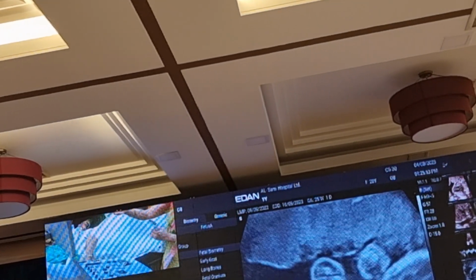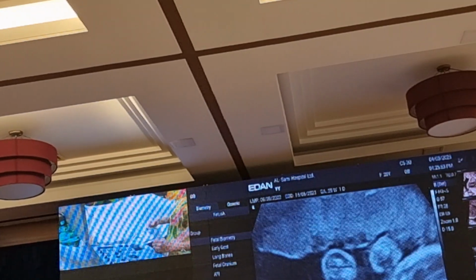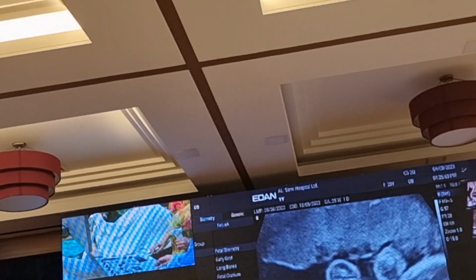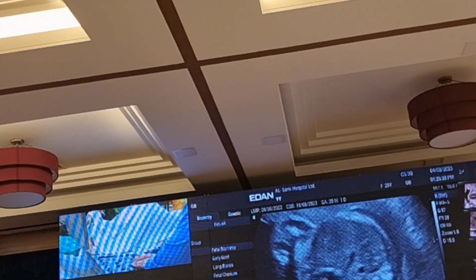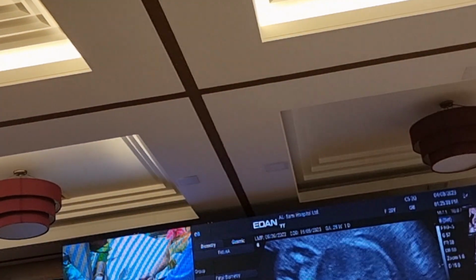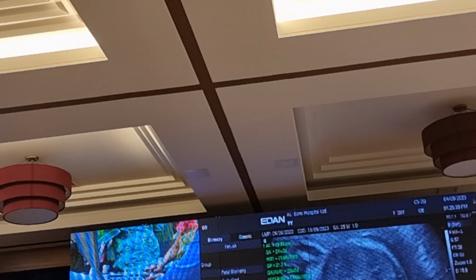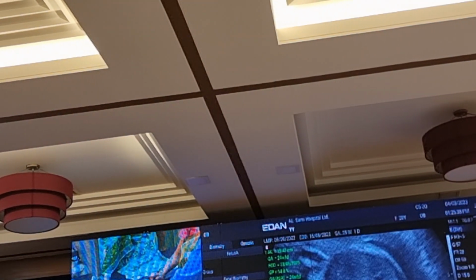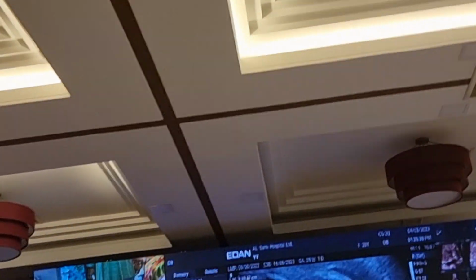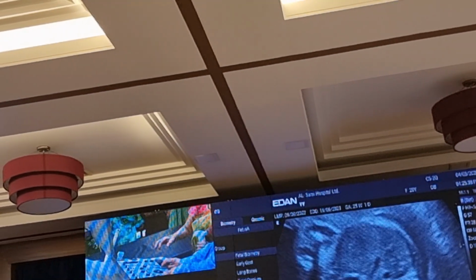We are frozen, so we made it afterward, because she is uncomfortable. Placenta is happy. Those three images. So the patient was uncomfortable, so what we have done is we have done the biometry quickly, and Joyti has frozen three images of the fetal brain, which are the basic views which we take for fetal CNS.